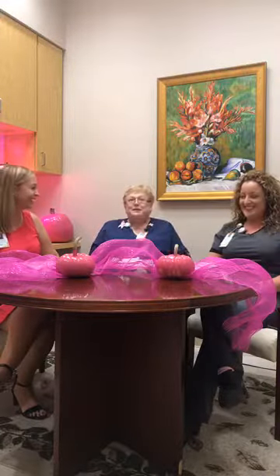All of this is done in this area where we're sitting now, so you don't have to traipse all over the hospital or to other departments. And one of the nurses again will come over, be present. The mammotech is the star of the show on that, because they're the ones that tell the doctor, this is what we saw and this is where it is. And then the radiologist will insert a very fine wire in that area. You don't have to be put to sleep for that. They put a little anesthesia there, and then they go to surgery, and that helps the surgeon know exactly where they need to biopsy.